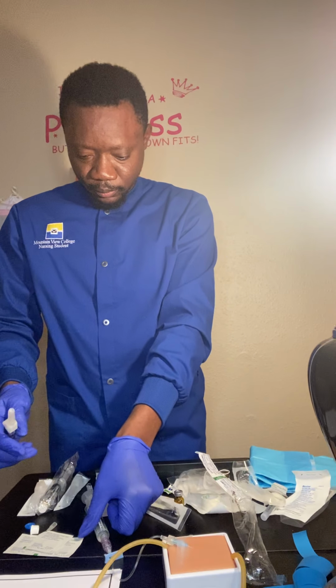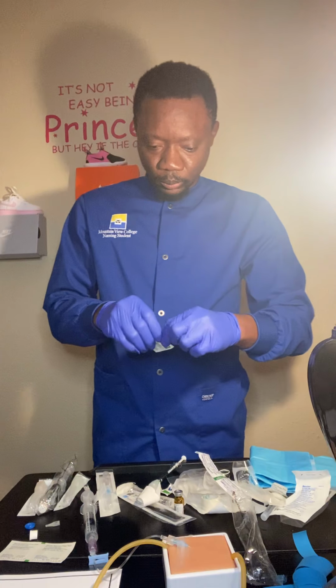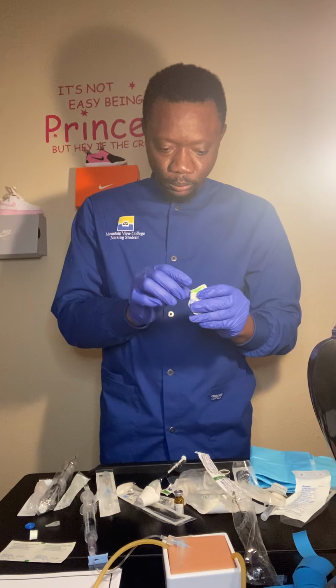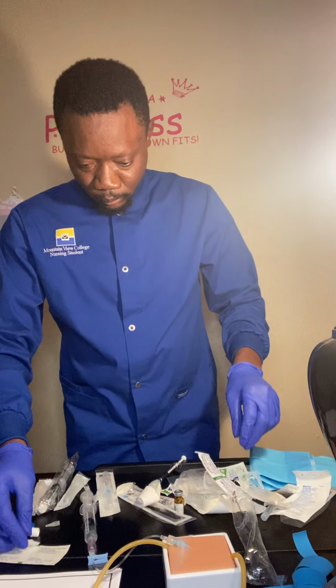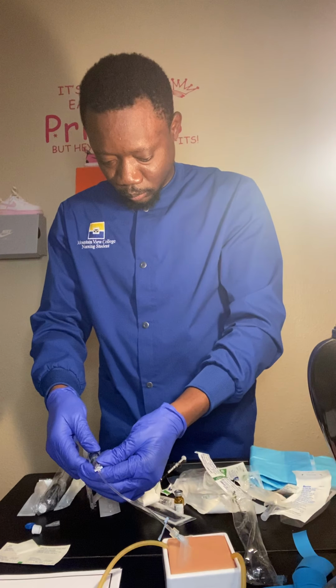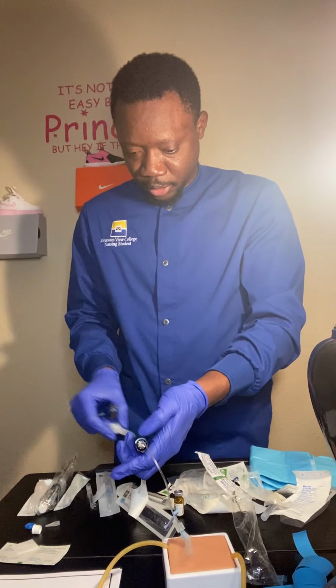So I should go ahead and get another alcohol. So I should unscrew my saline. Screw my medication.